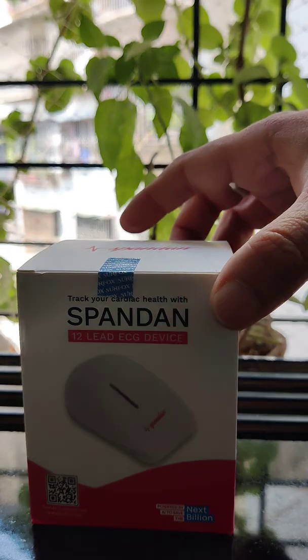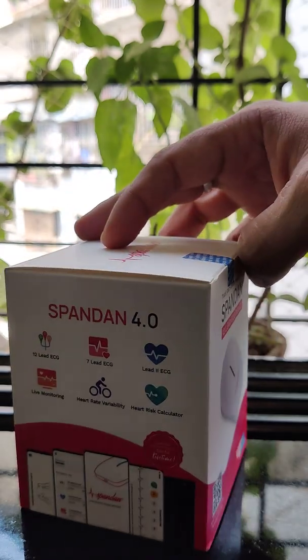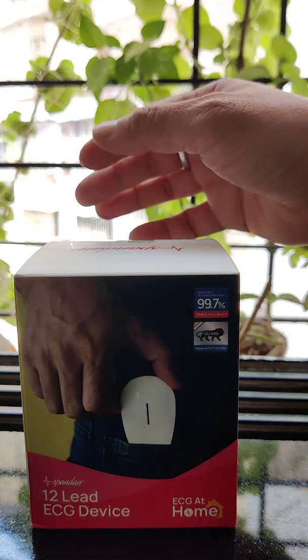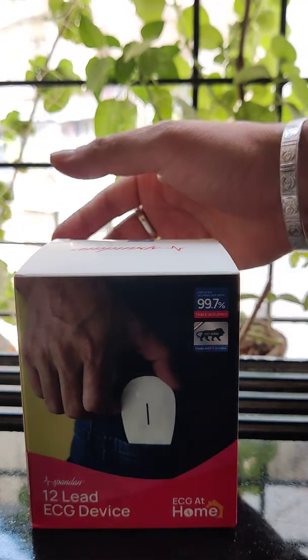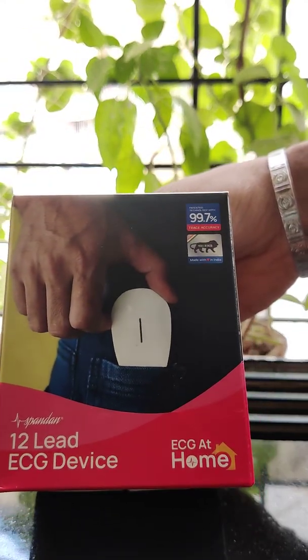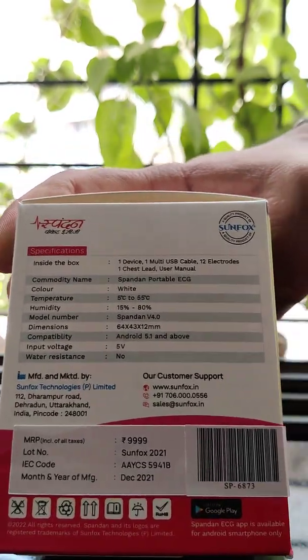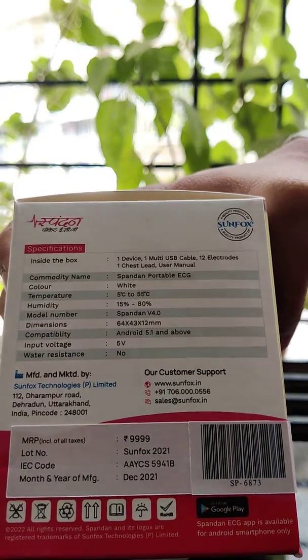Here you go friends — this is the new Spandan 12-lead ECG device. It is a very small device and we have all the relevant information on the box itself. The ECG device claims 99.7% accuracy as compared to traditional ECG monitors. It is very compact and can fit in the smallest pocket of your jeans. We also have the Made in India logo, which is a great thing — a product conceptualized, developed, and brought to market by Indian people.